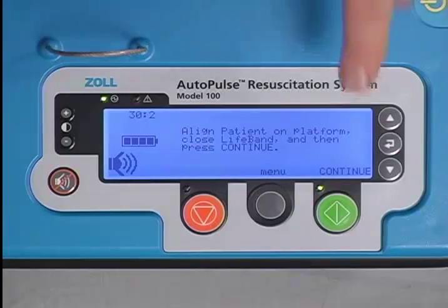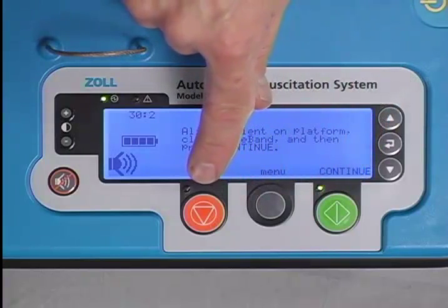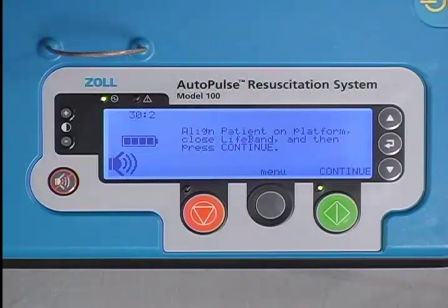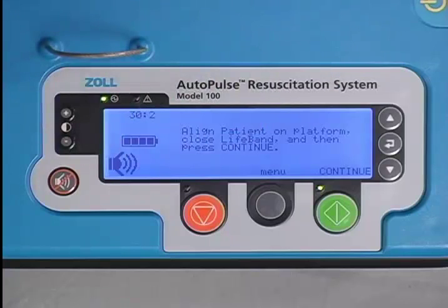At the bottom of the user control panel are the green go and orange stop buttons, which are integral to the operation of the device. The mute button, once pressed, disables all audio alert tones except for the low battery warning, ventilation tones, and pause alert tones.